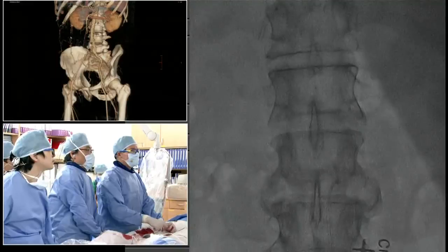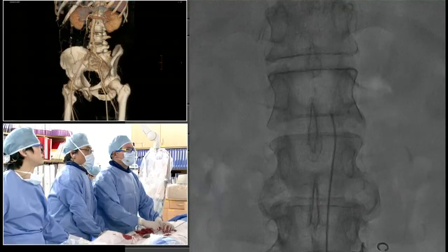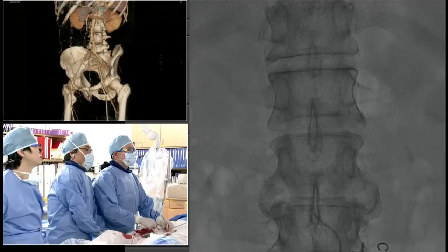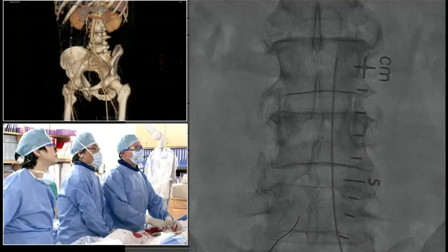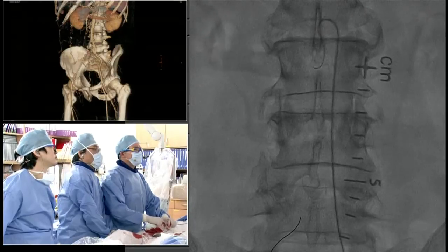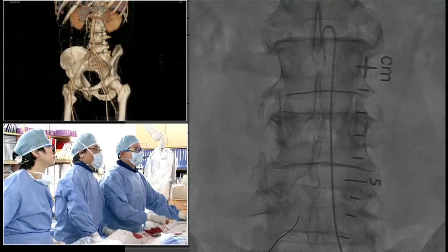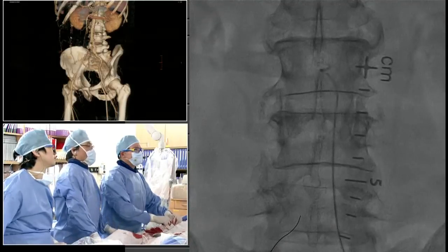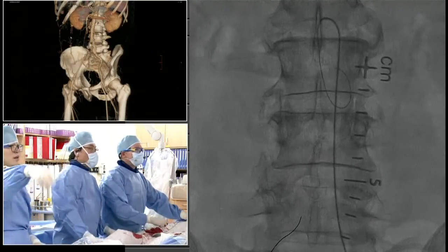Right, when the CTO extends distally, it's a little bit trickier, though. Is this kink permanent? Well, the other thing we have to think about is that the narrowing of the external iliac artery on the right side may not be atherosclerosis, just a spasm or shrinking after a stop of the blood flow. Sometimes we use IVUS observation. If the external iliac artery size is just a 3 millimeter diameter, that means it's just stop-flow induced vascular spasm downstream.